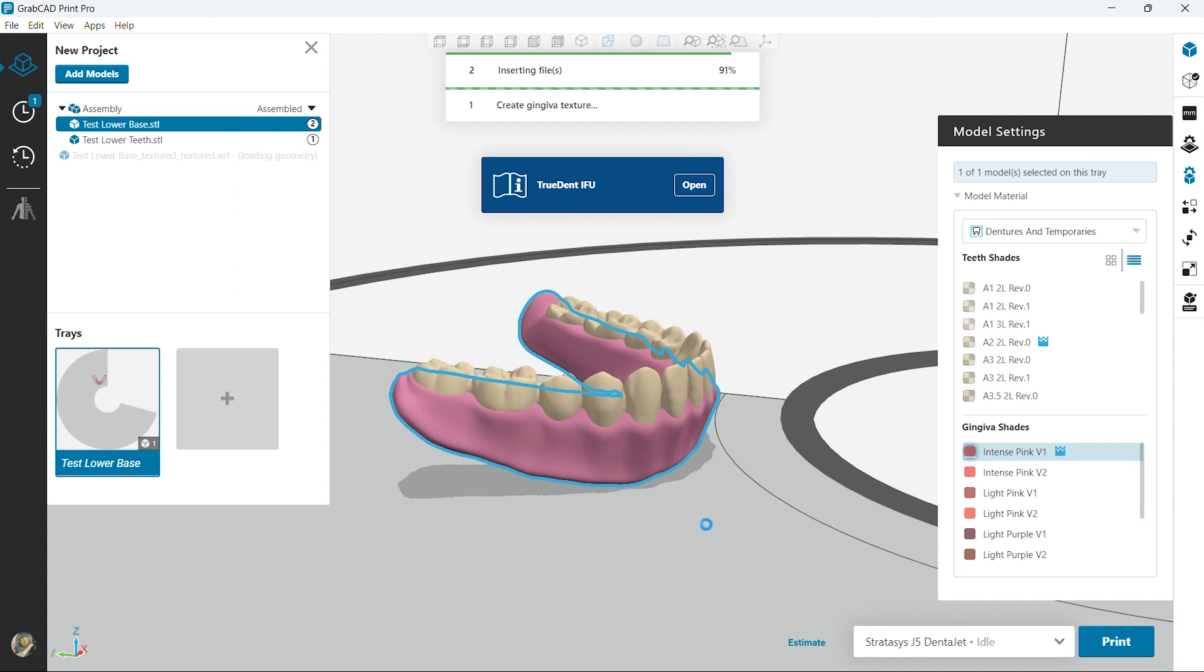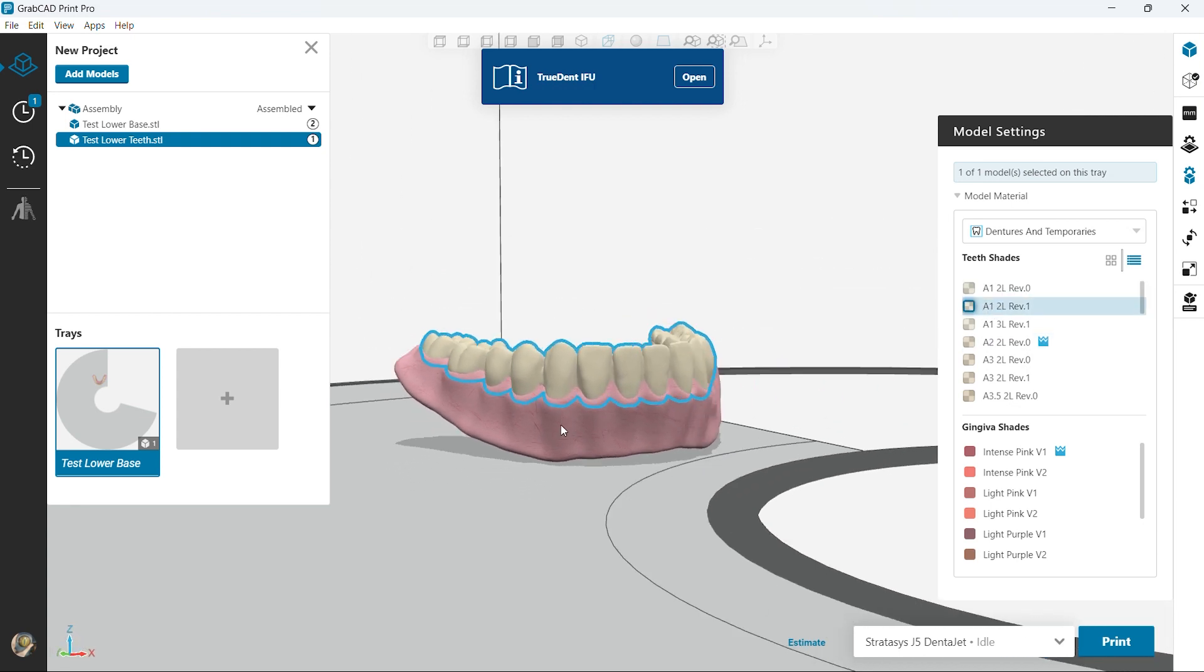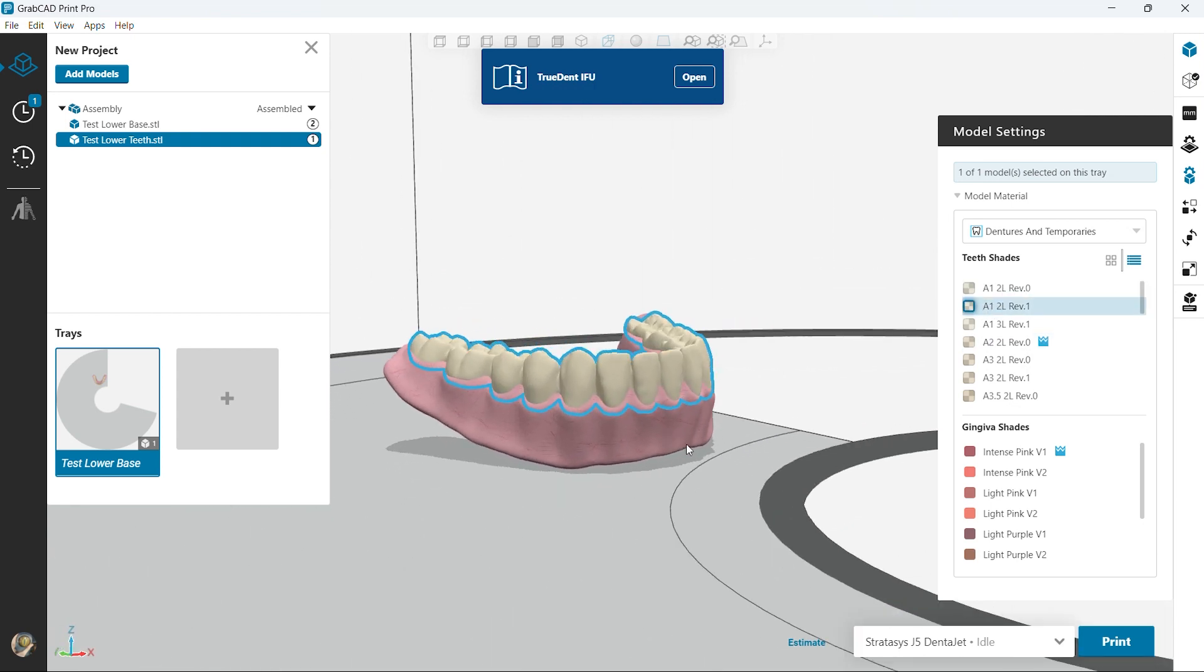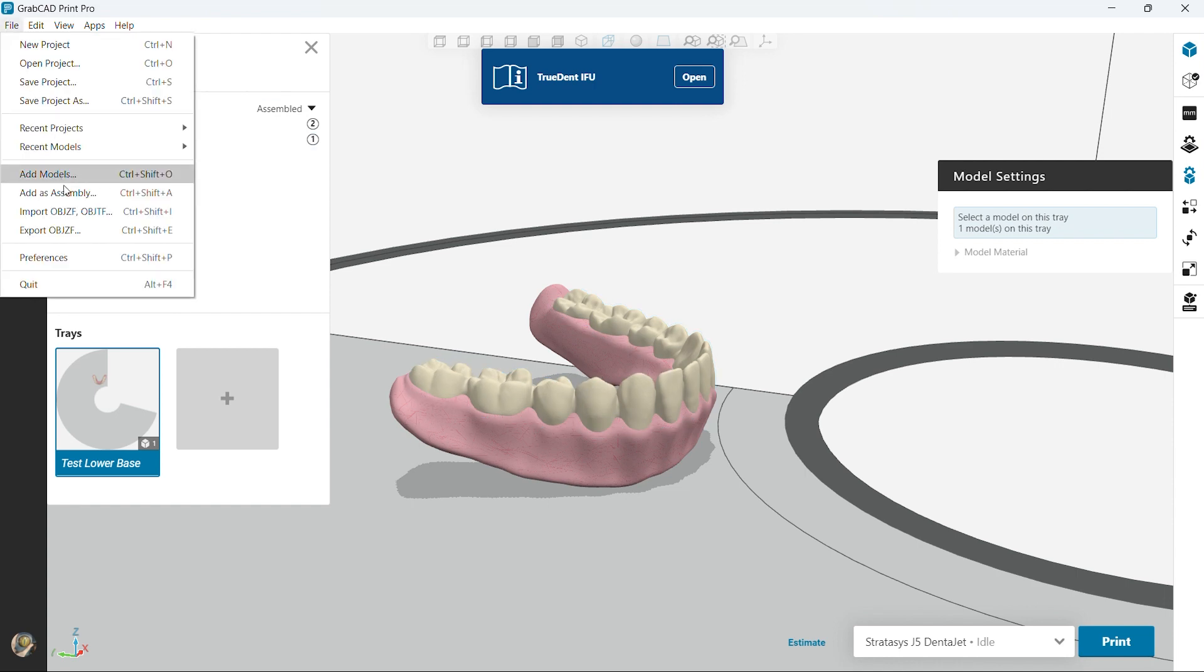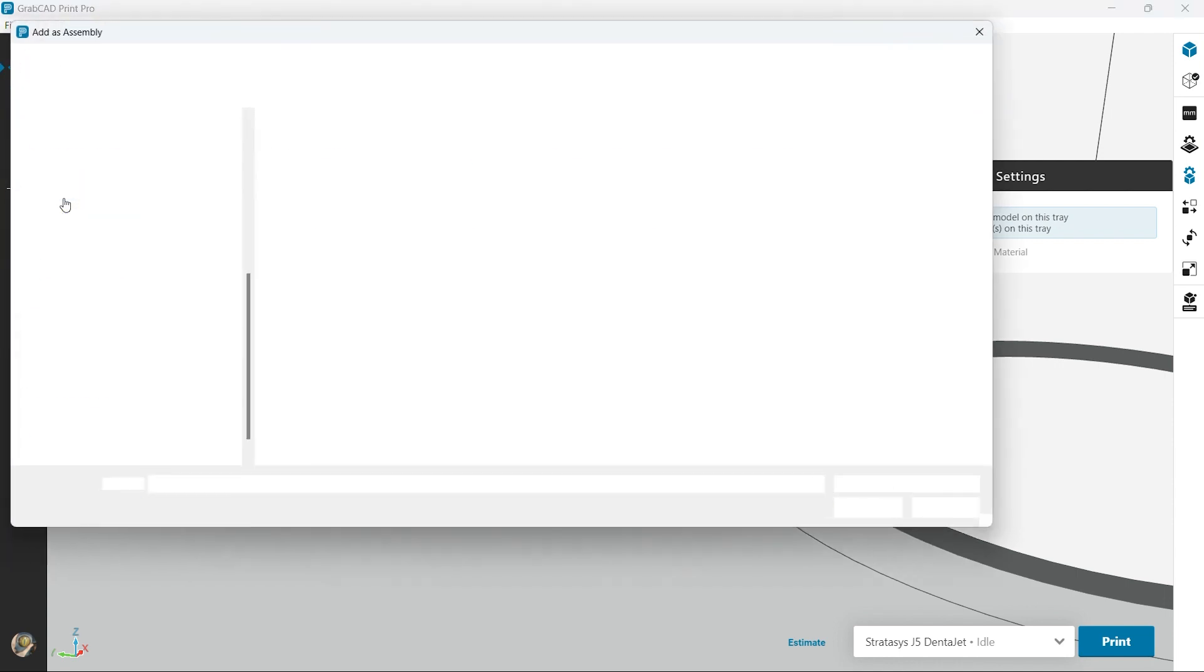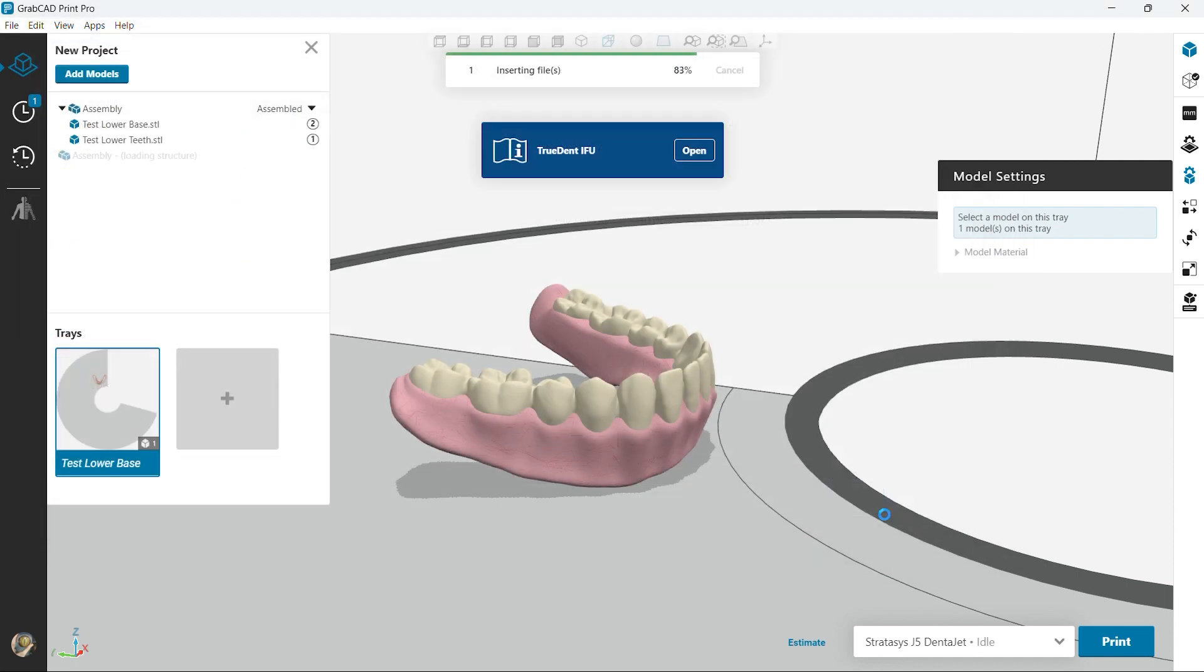We're gonna look at the different teeth shades as well. We can play with an A1. Please note that the colors here are kind of an estimation.